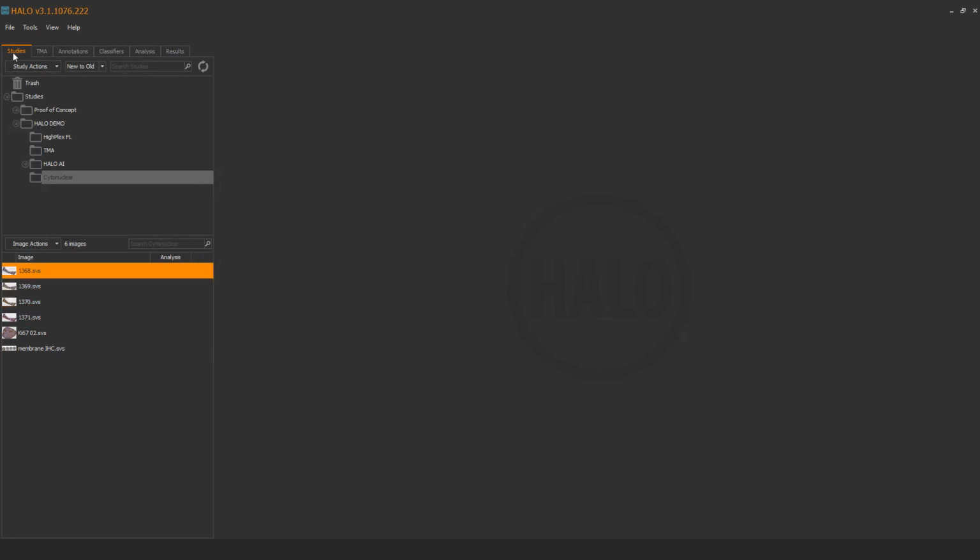Okay, so I'm going to start now with the software itself. You've got a series of tabs across the top toolbar, or second from top toolbar, that allows one to proceed through a workflow. First, opening it and organizing images within the study. And then you have an option for management of TMAs.